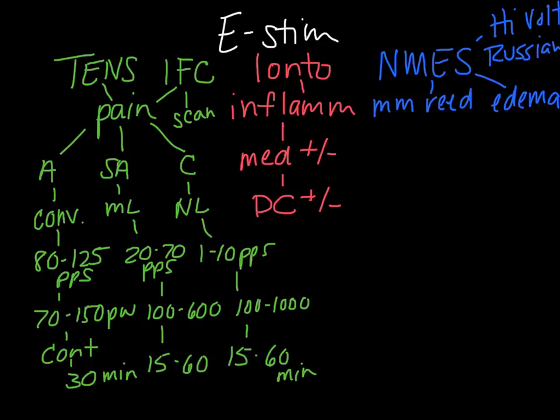Using some of the newer machines, those actually have a plus minus on the pad, so you just put the solution on the electrode that has the polarity that is the same as that solution. And then you're going to deliver the treatment. It's dosed in milliamps per minute, and so depending on the machine, the standard delivery of iontophoresis, you're actually going to take the intensity, your milliamps, multiplied by the number of minutes, and that's how you get your milliamp minutes. So for example, a dosage of 40 milliamp minutes might be 4 milliamps for 10 minutes.